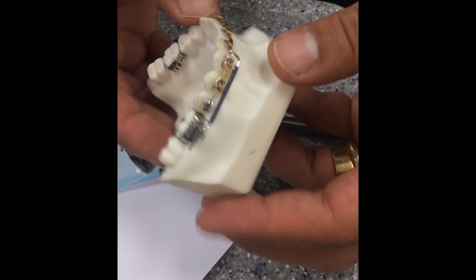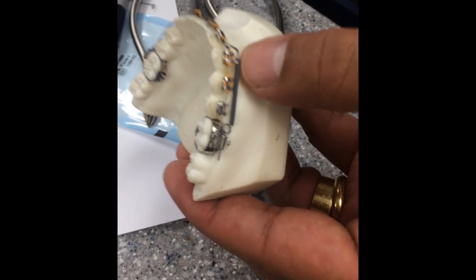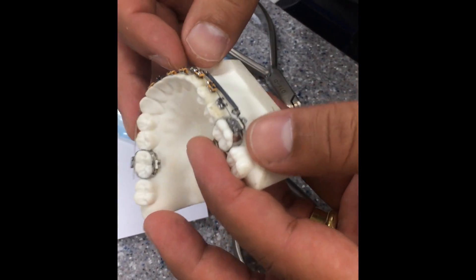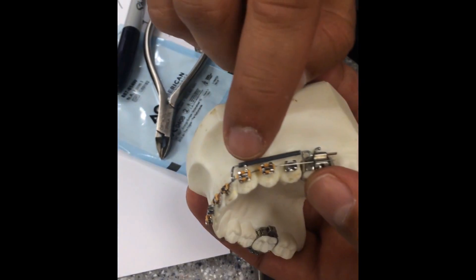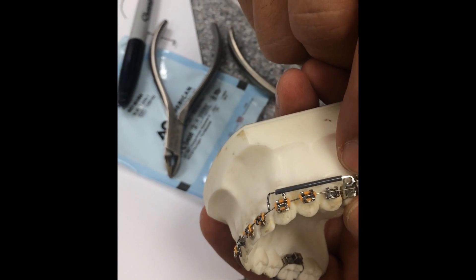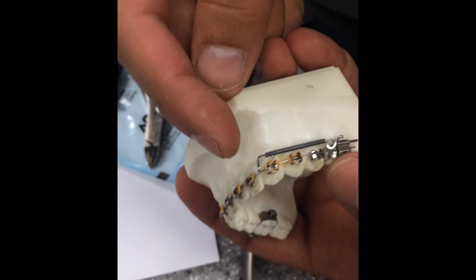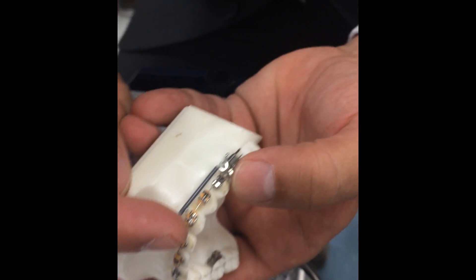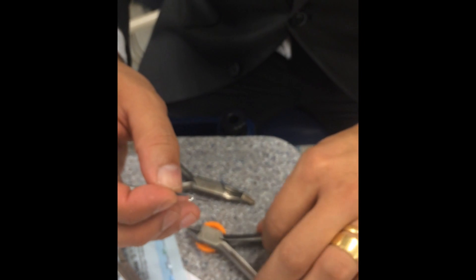Can you show it unhooked just to show the activation? And you always tell the patient that it's hooked, because eventually if it comes off, they'll know it's just to put it over the wire. If you have hooks like this and you want to increase the distance so it won't hit, you make your coil a little bit larger so the wire will go a little bit lower. And you make this a little higher too. Do it as little as you can, because if it gets too much down, there's a bigger possibility that it will hurt the patient.